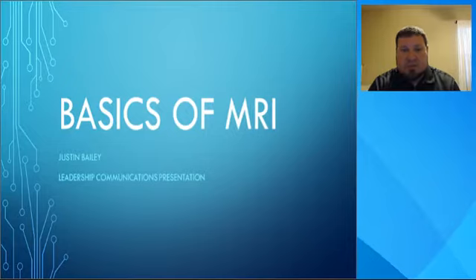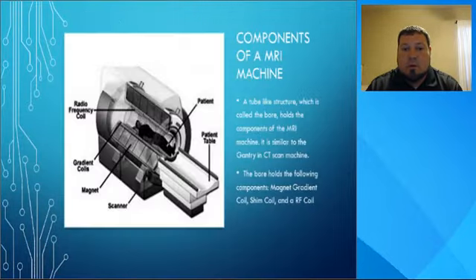My name is Justin Bailey and today I'd like to talk about the basics of MRI. I work with GE Healthcare, and in my profession, I work with magnetic resonance imaging on a daily basis. So the first thing I want to talk about is the components of an MRI machine.